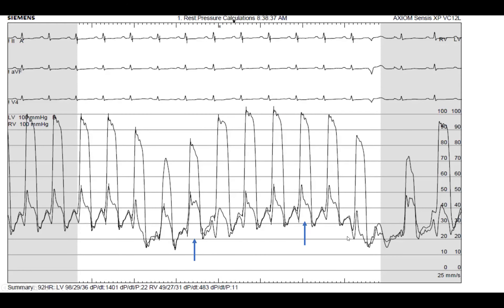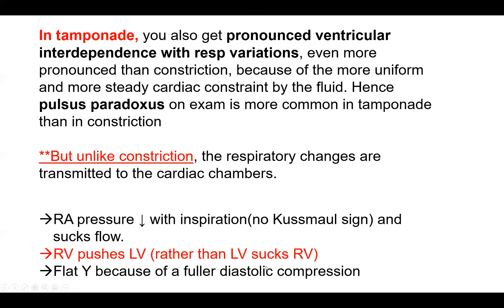So it tends to exaggerate the discordance — allowing one ventricle to fill excessively and compress the other. Here you have a PVC and post-PVC. If you compare pre to post, you can see marked discordance: the RV got bigger after the PVC whereas the LV is much shrunk. It exaggerated that inspiratory discordance and made it even more pronounced.